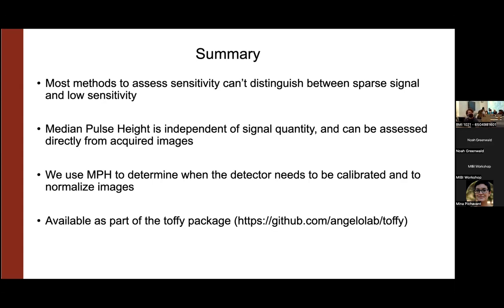One more thing. By the way, yesterday in the roadmap, I had a bullet on automated tuning. This is one of those. There's going to be a day, hopefully in the not too distant future, where the gain will just be maintained at optimal value automatically, essentially based on a lot of the underlying algorithms that Noah presented here, where they look at it manually and look for the optimal gain. We're working on doing it automatically. So hopefully detector gain becomes a thing of the past.